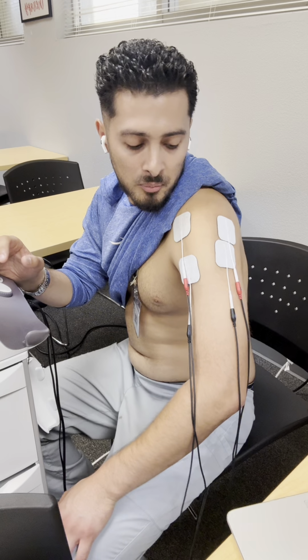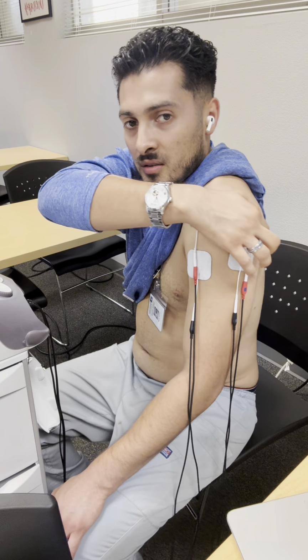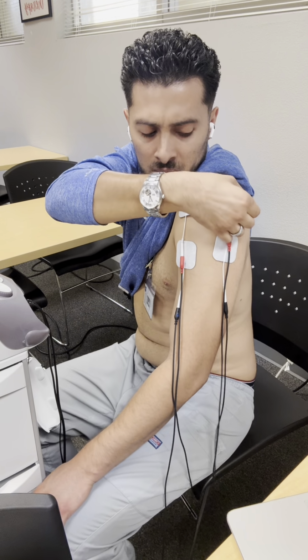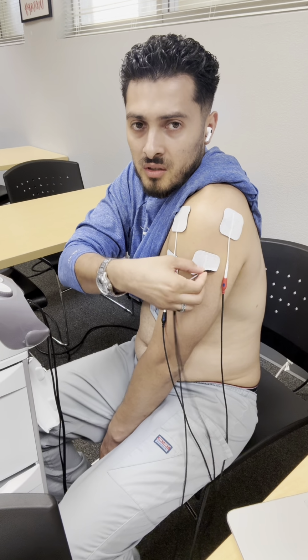I am noticing, I put these on myself, but I'm gonna pause it all here and readjust this pad. It's a little higher so it can be more spaced out. This one.